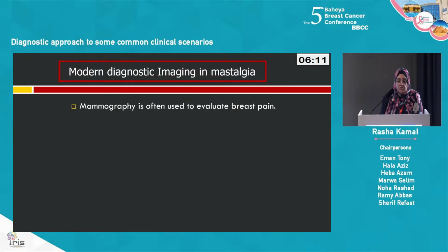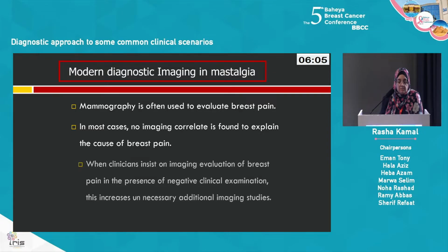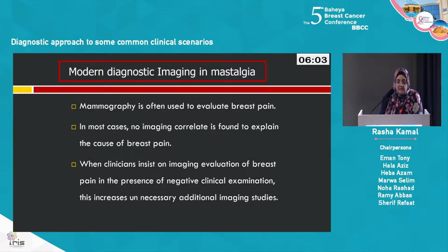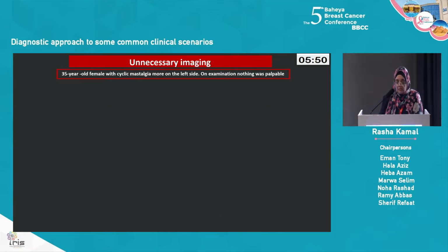Mammography is often used to evaluate breast pain, and in most cases, no imaging correlate is found to explain the cause of this pain. And when clinicians insist on imaging evaluation of breast pain in the presence of negative clinical examination, this increases unnecessary additional imaging studies. And this case is one good example to prove what I was just saying.